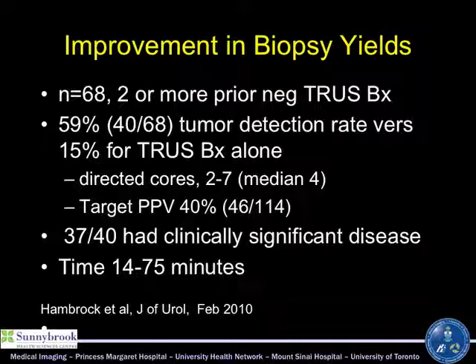It's pretty good. I think positive predictive values are running in the 40% range in patients with prior negative biopsy, 50% in other series. In our hands, in this scenario, I think in Canada the PSA ranges are much higher. Because of the long waiting list, the urologists are selecting out patients with higher PSAs. Our PPV rates are running around 80%. But I think that's a function of having a lot more higher risk patients because of lack of access.